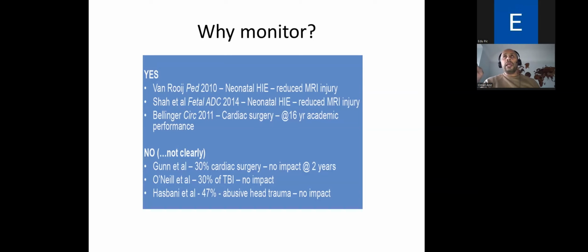So for any monitoring tool, I would challenge you to provide me evidence that on an intensive care unit you need to monitor SATs. Obviously, we need to monitor SATs because that's what we do, and that's ingrained in our practice. It provides us information for assessment, and I'd be worried about any modern day intensive care unit that doesn't monitor SATs, because that's one of the things we can adjust in terms of oxygen, rather than just being reliant on our eyes to see when a patient is hypoxic.